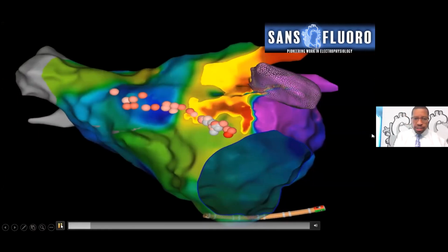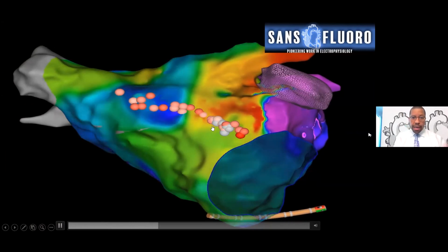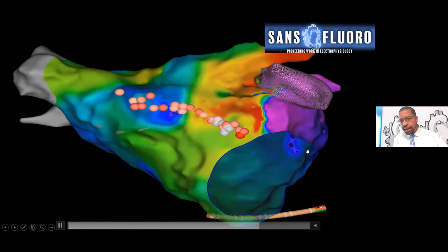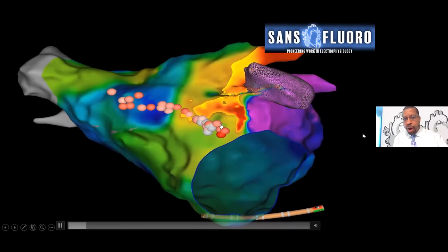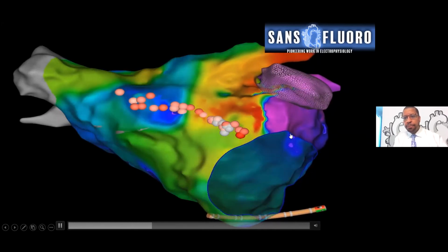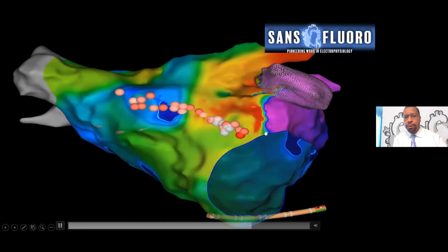All right, so this is just a basic propagation where we're looking at the left atrium in an AP view, all right? And here was the early meets late again, but this is the mitral annulus here, and you see that it propagates in a counterclockwise manner. Let's see if I can get it to play again, all around here and goes back up, okay? Clearly consistent with what looks like a mitral dependent counterclockwise flutter.